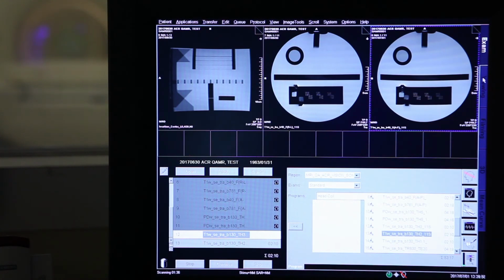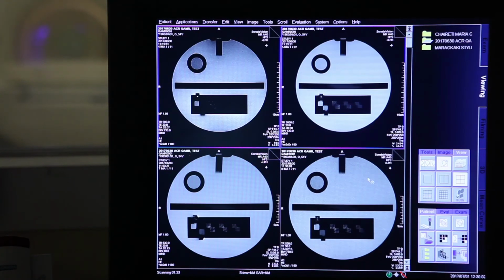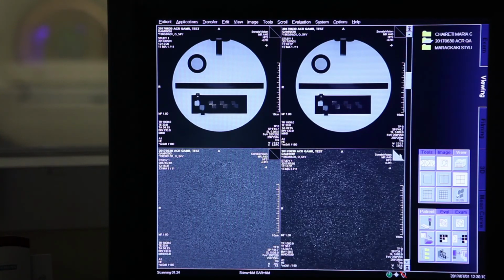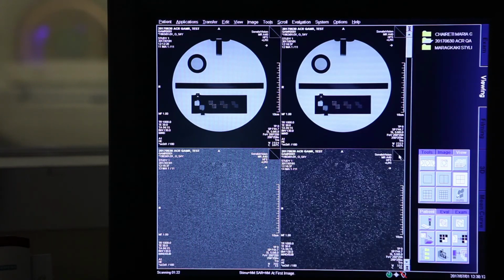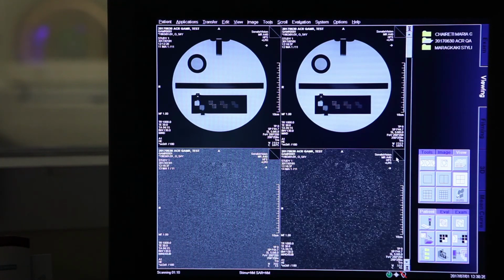We're going to make some measurements on the SNR. Remember the SNR1 and the SNR2. There it is. We can see them now. We want to have the 6th slice. The white background is for the shifted, the gray, and the dark background is for the 0, the non-application. Half of the noise, exactly.